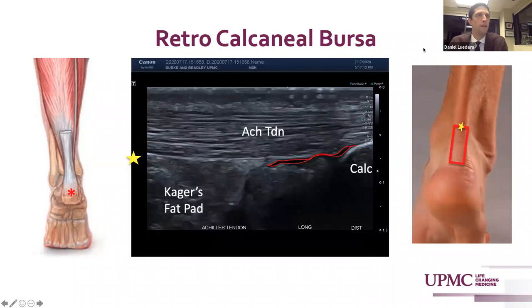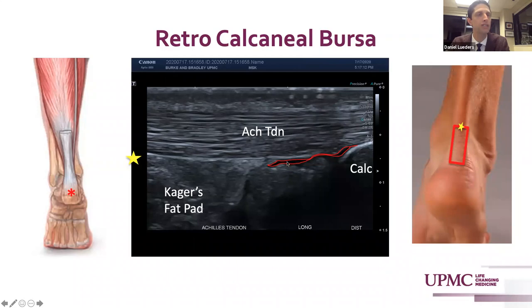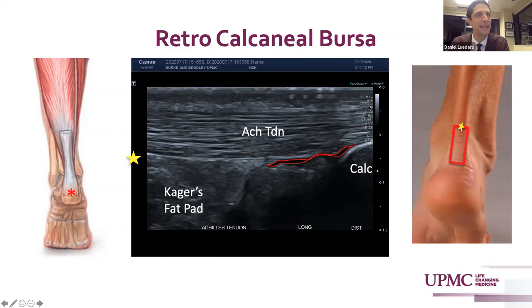The retrocalcaneal bursa lies between the posterior calcaneus and Kager's fat pad and the Achilles tendon. Here we see it just minimally distended with fluid, but this can become rather largely distended with fluid and have a notable increase in vascularity, so turning on color Doppler here is prudent. The retroachilles bursa is a potential space that lies between the Achilles tendon and the skin, and a gel standoff must be used to ensure you don't compress this potential space. The retroachilles bursitis is more commonly a contact or friction bursitis, whereas the retrocalcaneal bursitis is more commonly associated with Achilles tendon pathologies.